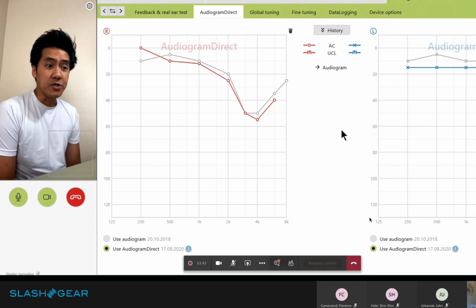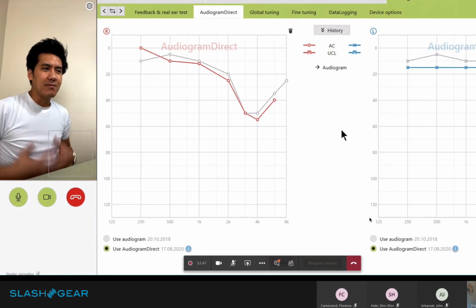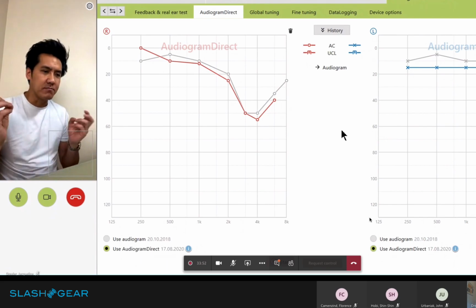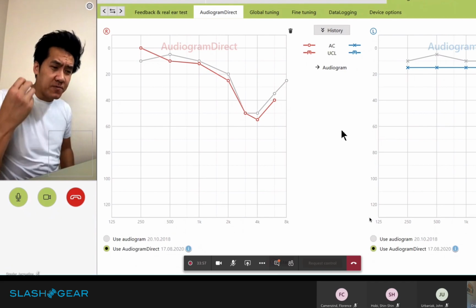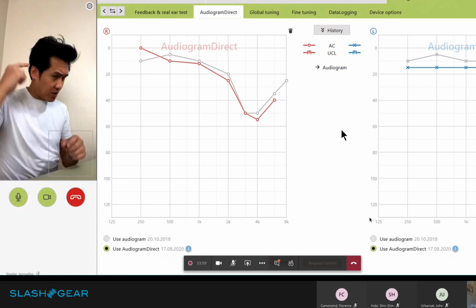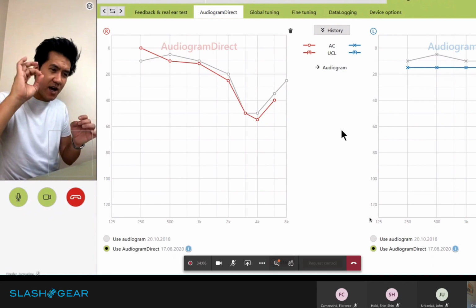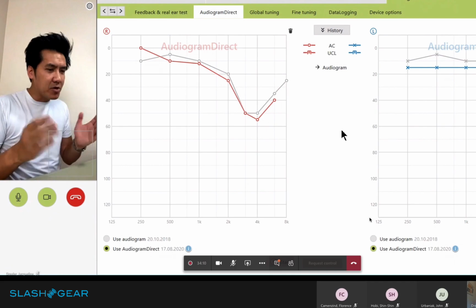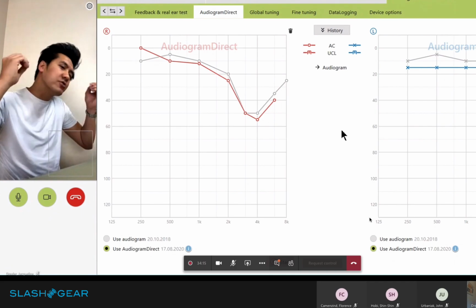It's been really good. I'm very shocked that I'm able to hear my own voice, which is great. There aren't any major feedbacks. There are times where the microphone feels really sensitive, so I can hear some higher pitch. Do you know what I'm talking about? Like it's a higher pitch frequency that's buzzing in and out. It doesn't happen all the time, but every now and then when I put them in, I hear that high pitch.